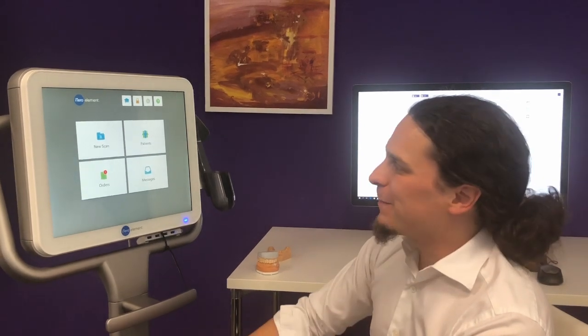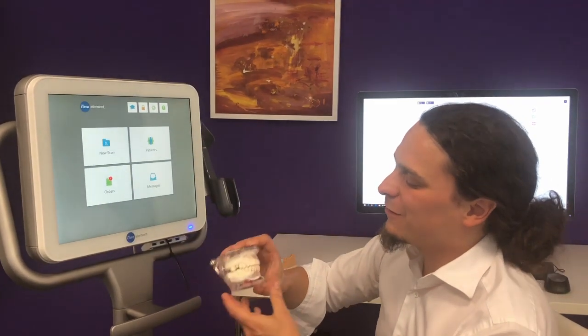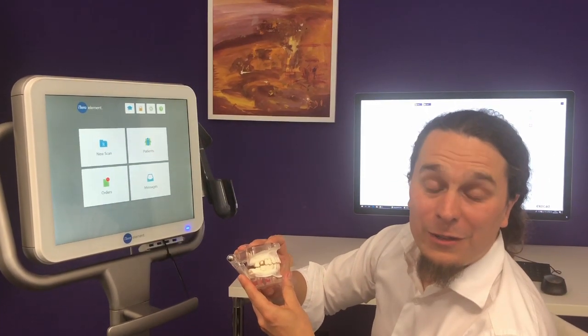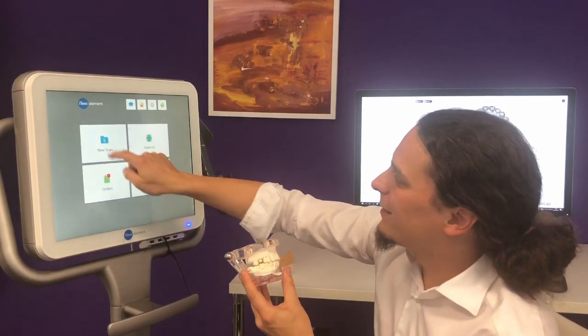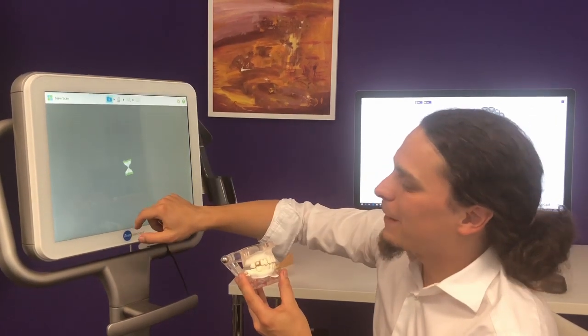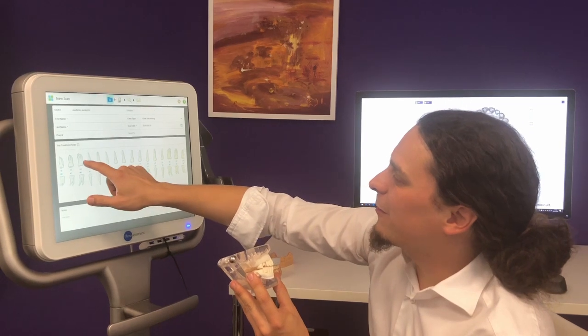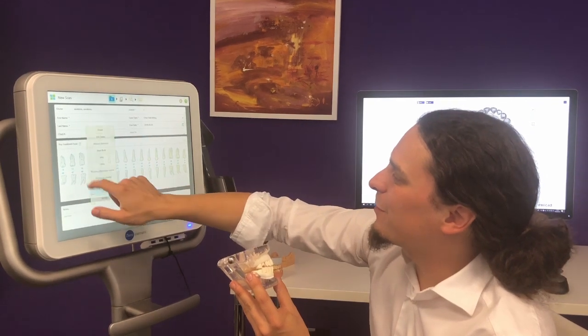Hi, I'm Till. In this video I'd like to show you the smooth integration between iTero Element and Exocad software in a chairside environment. We'll start with the case setup. We'll set up a case not for a real patient but for this plastic demonstration model which needs a crown on the first upper molar.